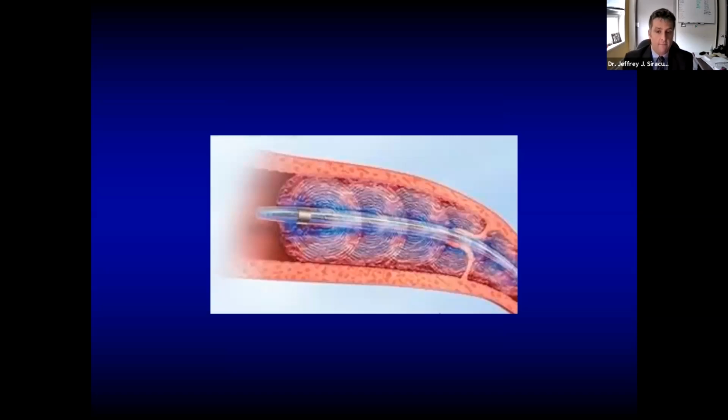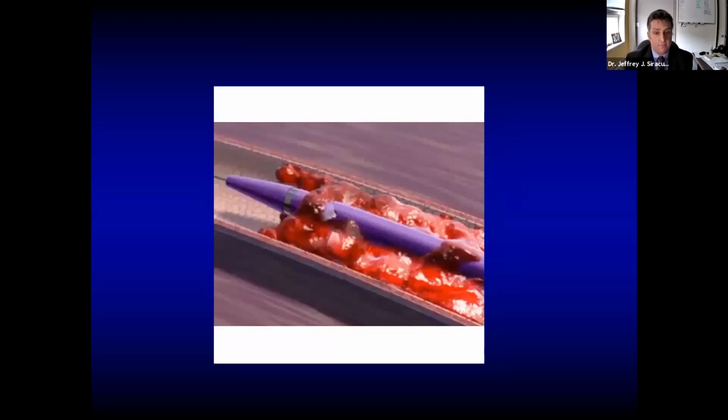Some people do EKOS for shorter time and better results, an ultrasound-guided, ultrasound catheter. I've done AngioJet procedures before, where you go in with the AngioJet and open it up. This can help debulk clot, allowing, if you want to leave a lytic catheter, less clot burden during the time for it to work, and you may decrease your lytic time as well. There's a 6 French one, a smaller one you can use to get down the foot if you need to, and also a bigger 8 French one, the Zelante, that has directionality to it.